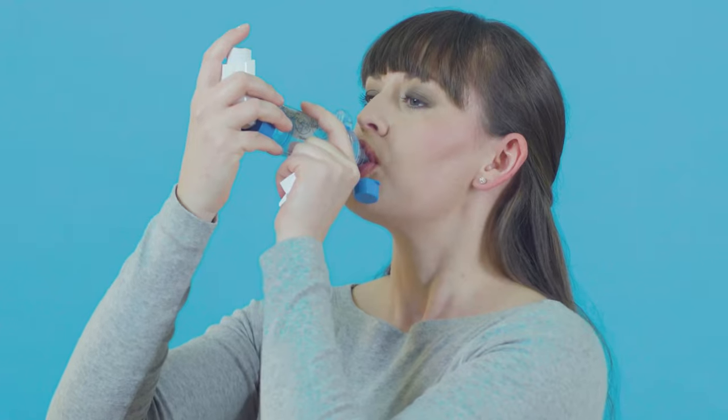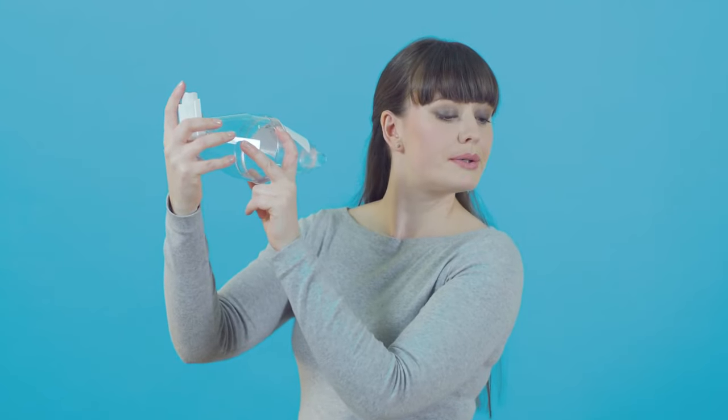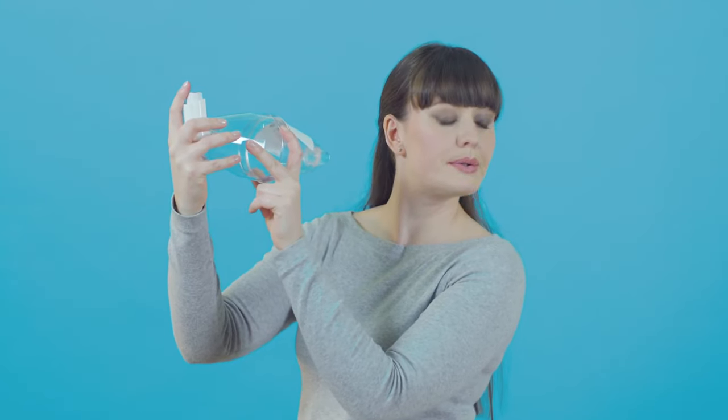Some small volume spacers make a whistling sound if you're breathing in too fast. If you're using a large volume spacer like this one, you can use the same breathing technique.